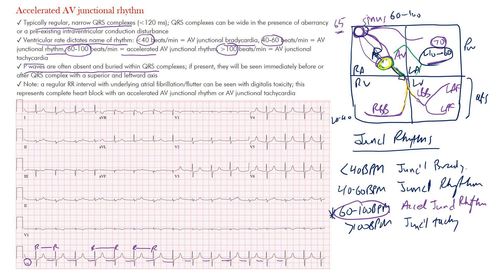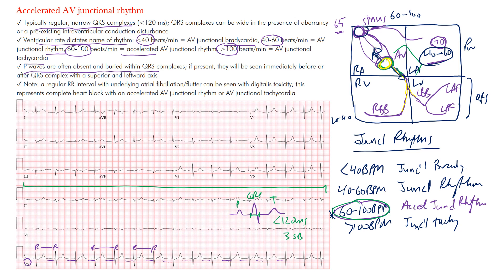Because the intervals are the same, this is a regular rhythm with a narrow QRS complex. The QRS complex width — from beginning to end — should normally be less than 120 milliseconds, or three small boxes, and that is the case here. The rate must be between 60 and 100 beats per minute to call it an accelerated junctional rhythm.